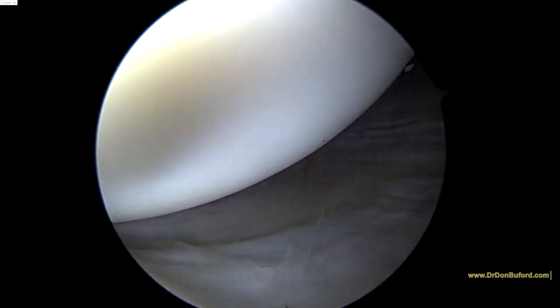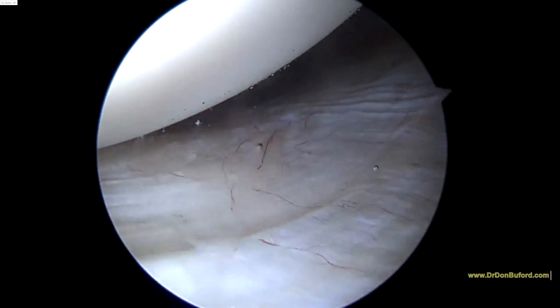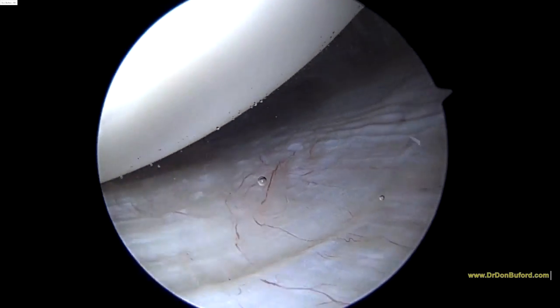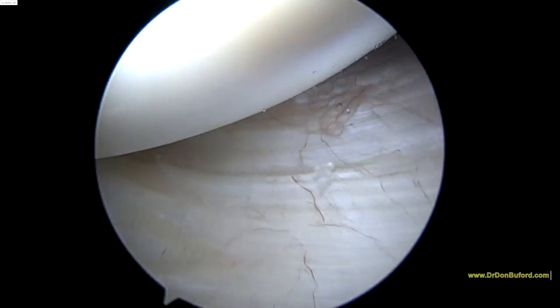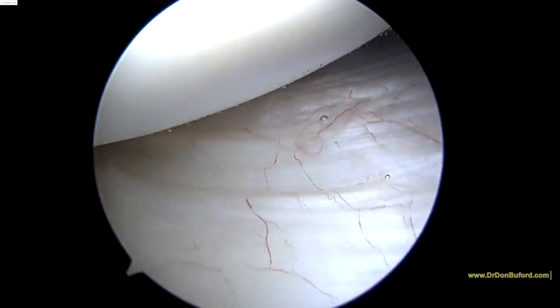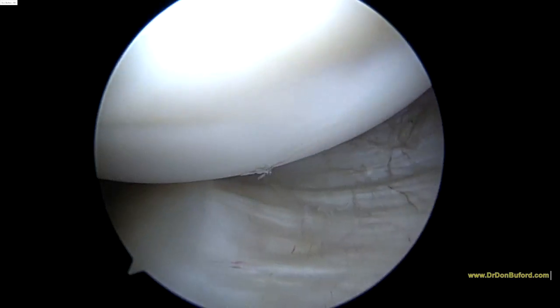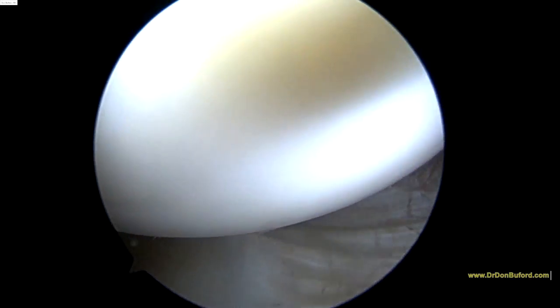Now this is the glenoid. This is the posterior aspect of the shoulder. You can see there's no significant posterior band of the inferior glenohumeral ligament in this particular patient.